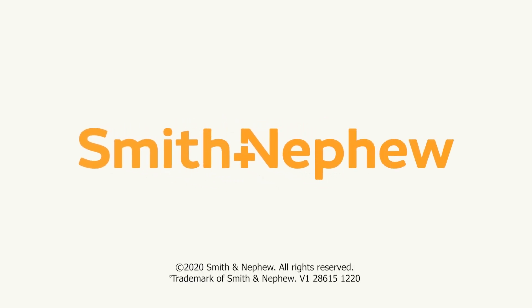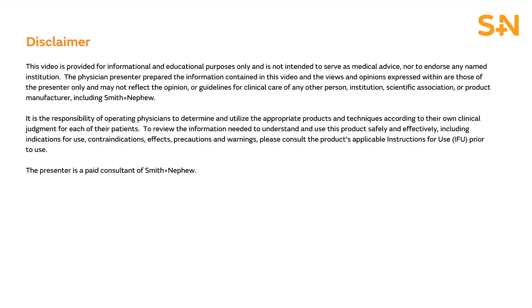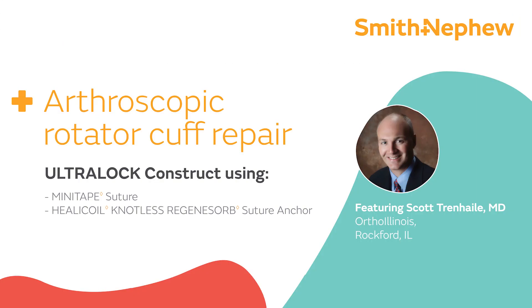My name is Dr. Scott Trenhill, and I'm here to present a video of a rotator cuff repair using mini tape sutures and the helicoil Regenosorb knotless anchor.